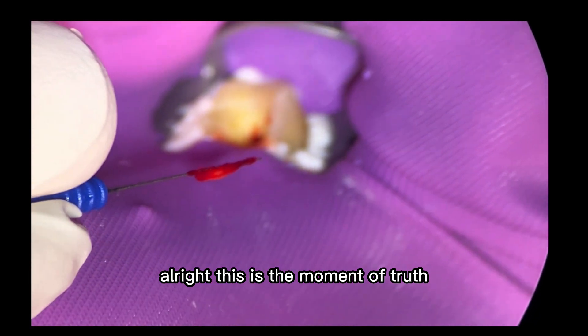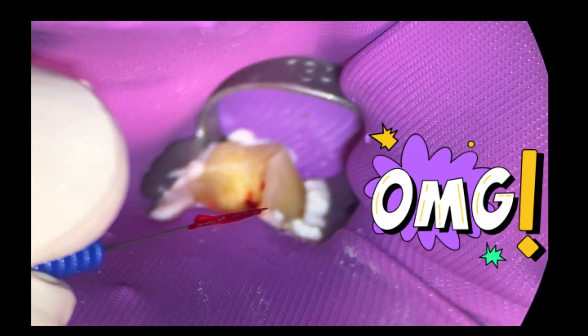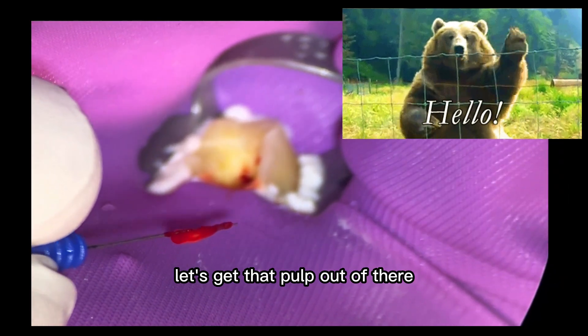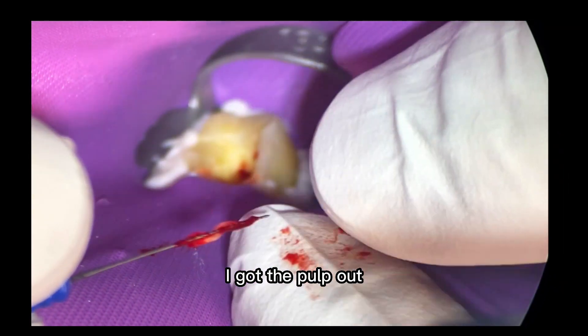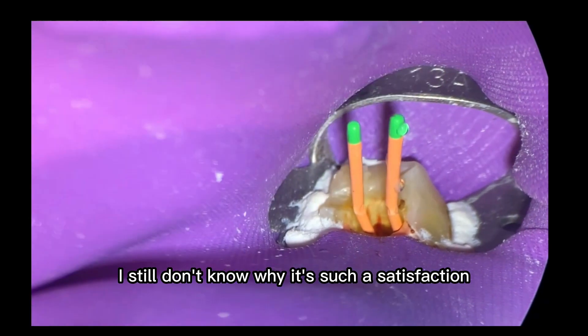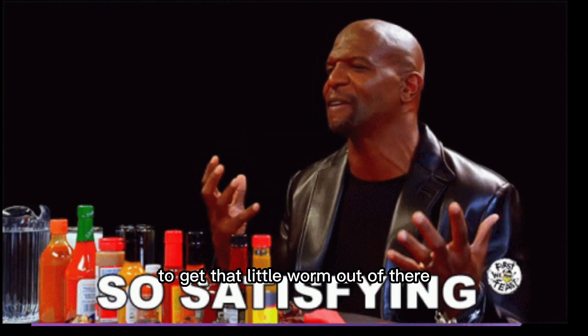This is the moment of truth for anyone doing root canals. Get the broach out. Let's get that pulp out of there in one shot. So that's the distal canal. I got the pulp out. I still don't know why it's such a satisfaction to get that little worm out of there.